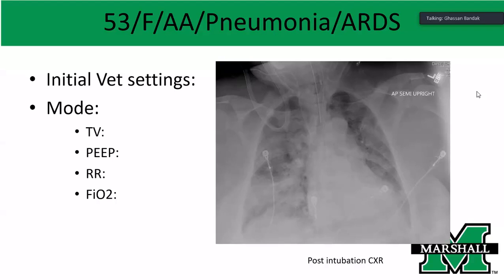Okay, so I think you're referring to the PEEP table. So there are tables out there that are published that correlate FiO2 to PEEP. There is a high PEEP table and a low PEEP table, and a PEEP of 10 is not high. Actually, it is on the lower side, right? If you look at the PEEP table for FiO2 of 100%, the PEEP is in the 20 range. Right, okay, right. But that's fine. This is what you chose to start.